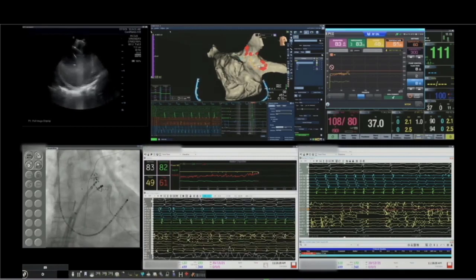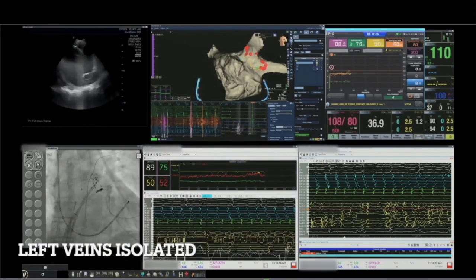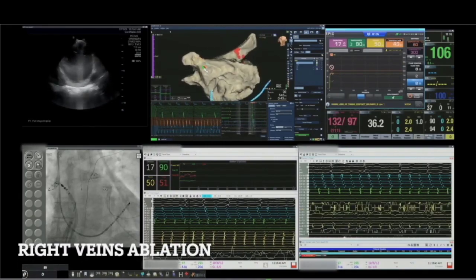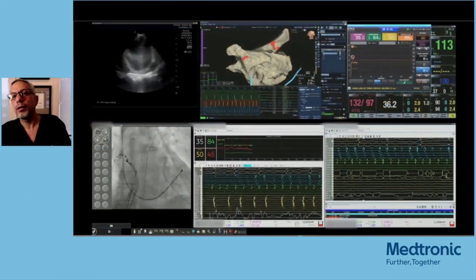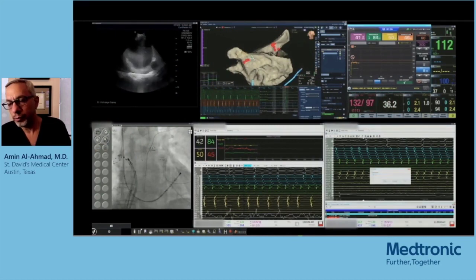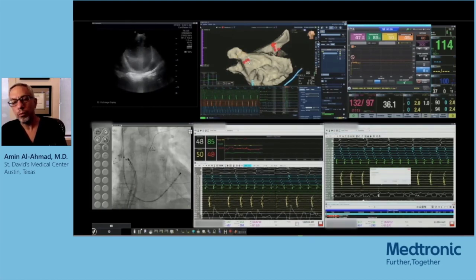There's my power changing. A couple of things that are interesting about this is that it actually kind of validates to some extent high power and short duration, if you will, because to achieve good tissue temperature, you do need to get up to 50 watts, which is interesting. And when I saw that, I was very intrigued by that. But what you're able to see pretty clearly is that the impedance will drop with these, and the power will go up. Now, one thing to notice is that occasionally the temperature may not always be at 50, and that may just be that you have to adjust your contact a little bit. And again, the issue is just a small tweak in the catheter. And again, the catheter moves micro motions very well.